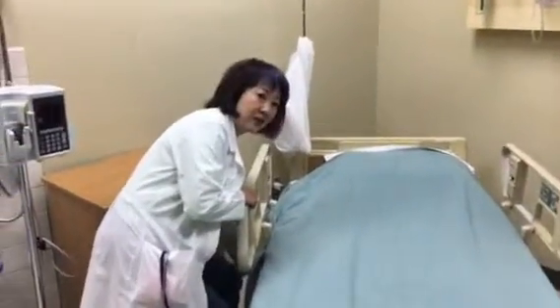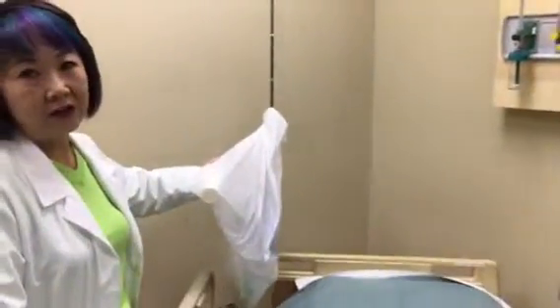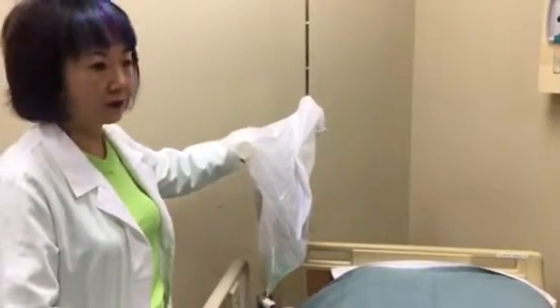So same the other side, we can raise the bedside. And this is a very important safety issue, in case your patient needs resuscitation and the ambu bag is available here.